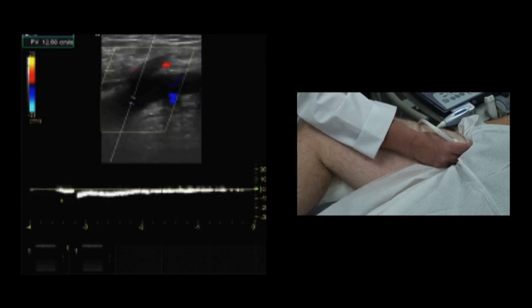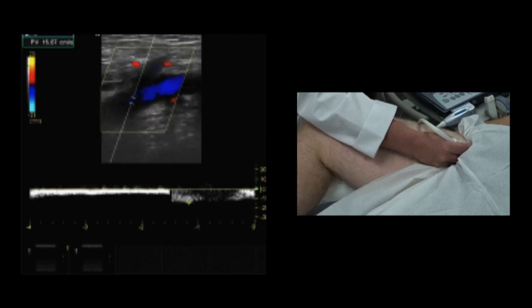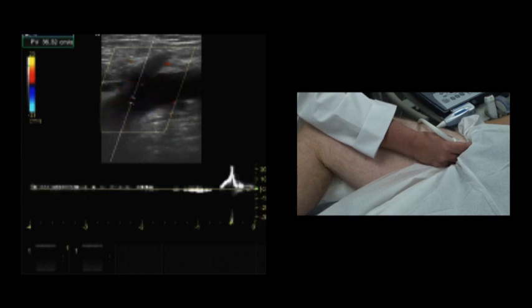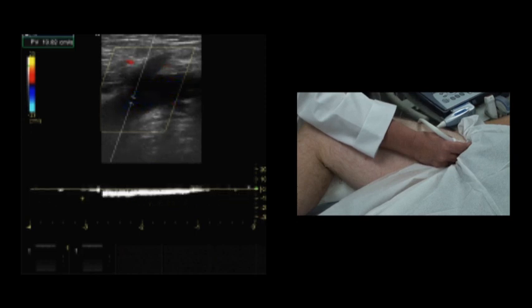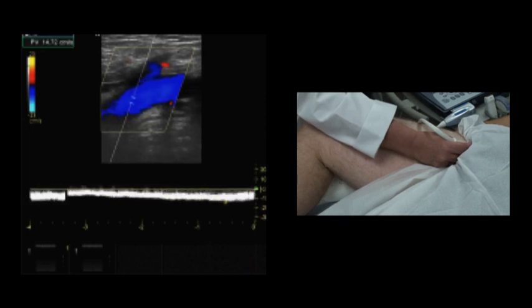What we want to do next is we want to evaluate whether there's reflux. And this can be done in two different ways. One can be done as a Valsalva, where the patient inhales, holds his breath, and then bears down. Let it out, please. And if you notice, there should be no flow when he inhales. If we have flow that is on reverse flow, which is going to show up on the other side of the line, that's letting us know that there is reflux.